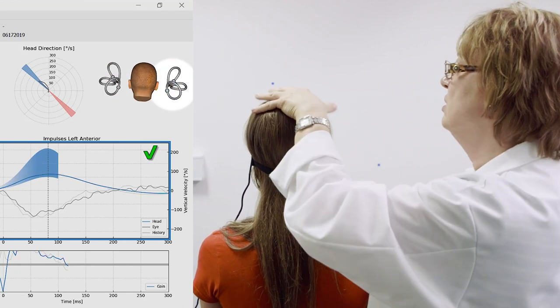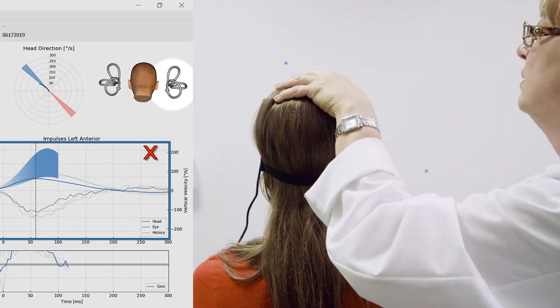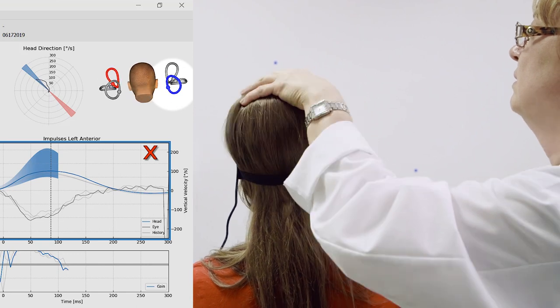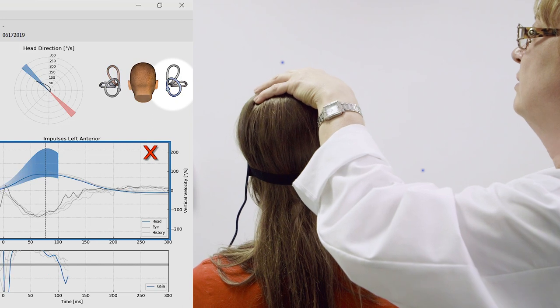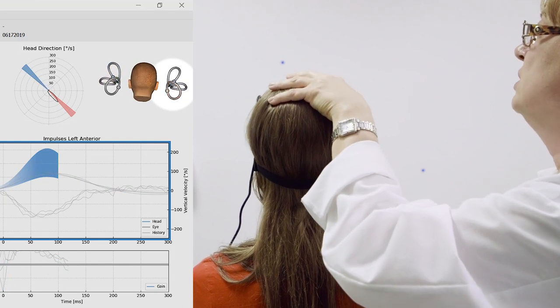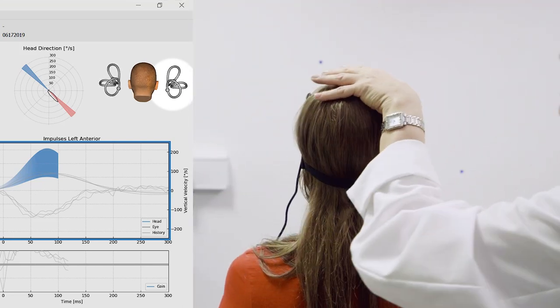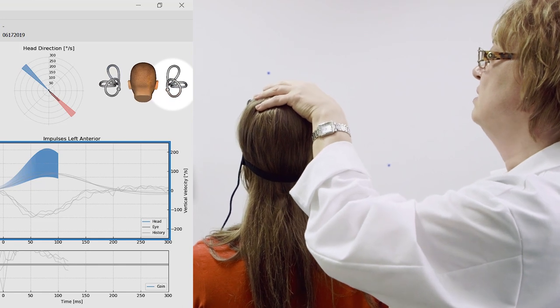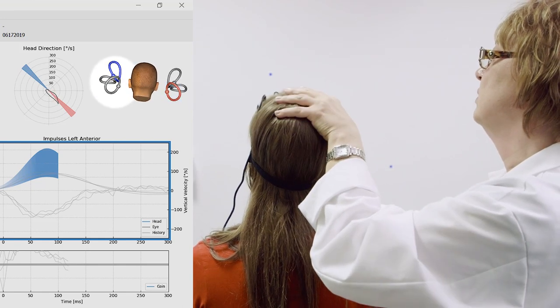The right posterior canal is turning blue because that one is inhibited. And then when I come back backwards, now you can see that the right posterior canal is the one that's being excited, so it turns red. And the left anterior canal is being inhibited, so it turns blue.